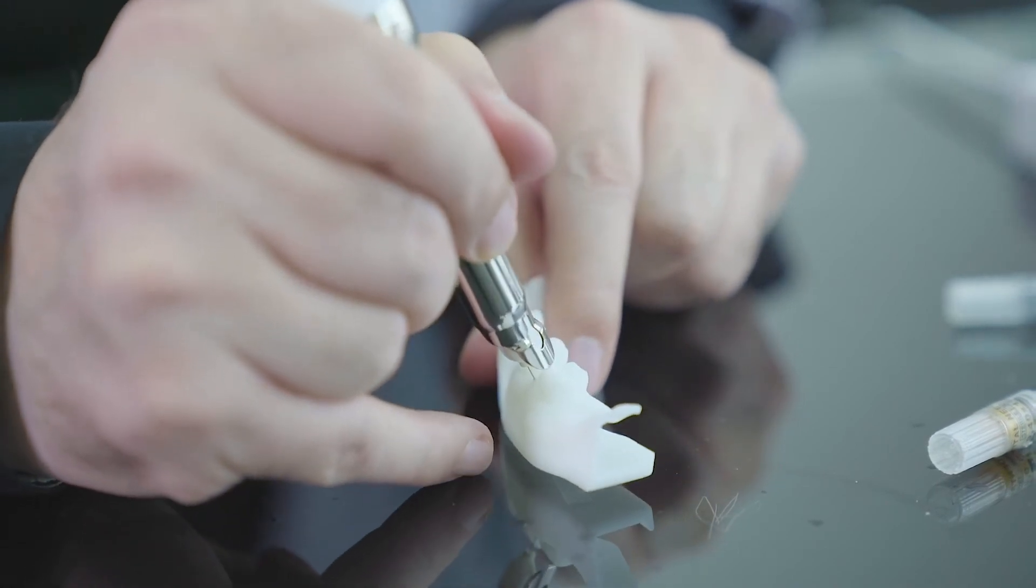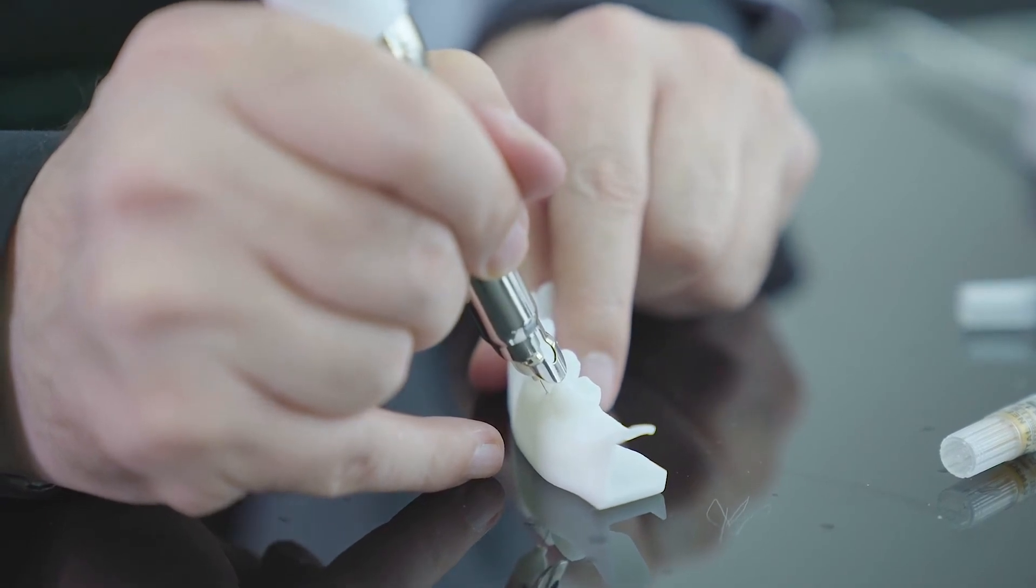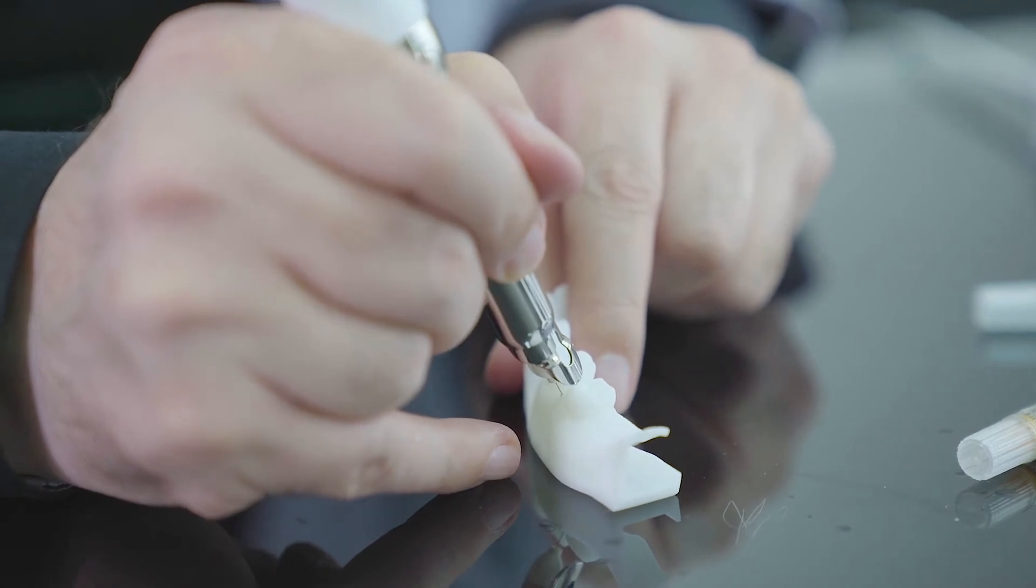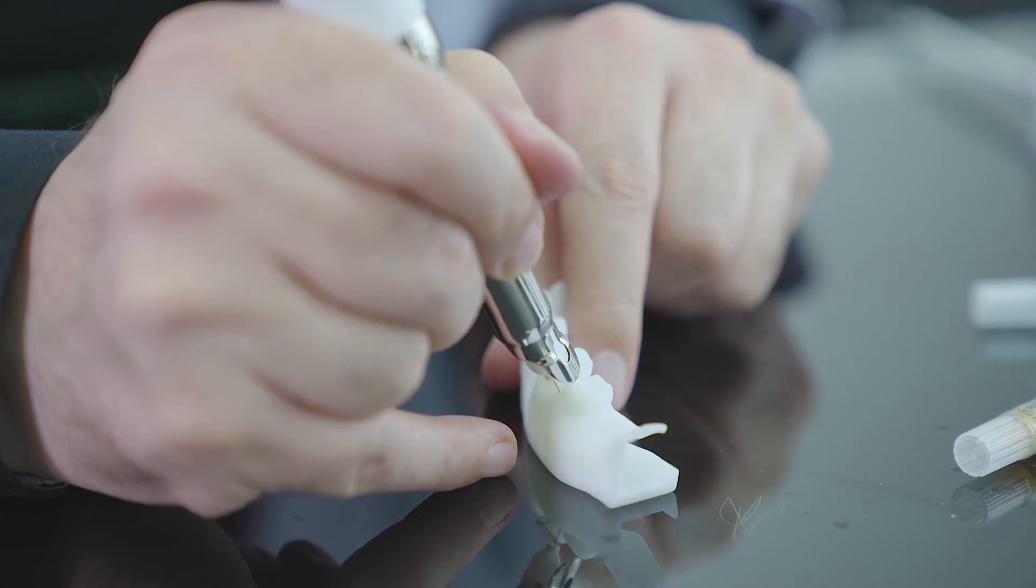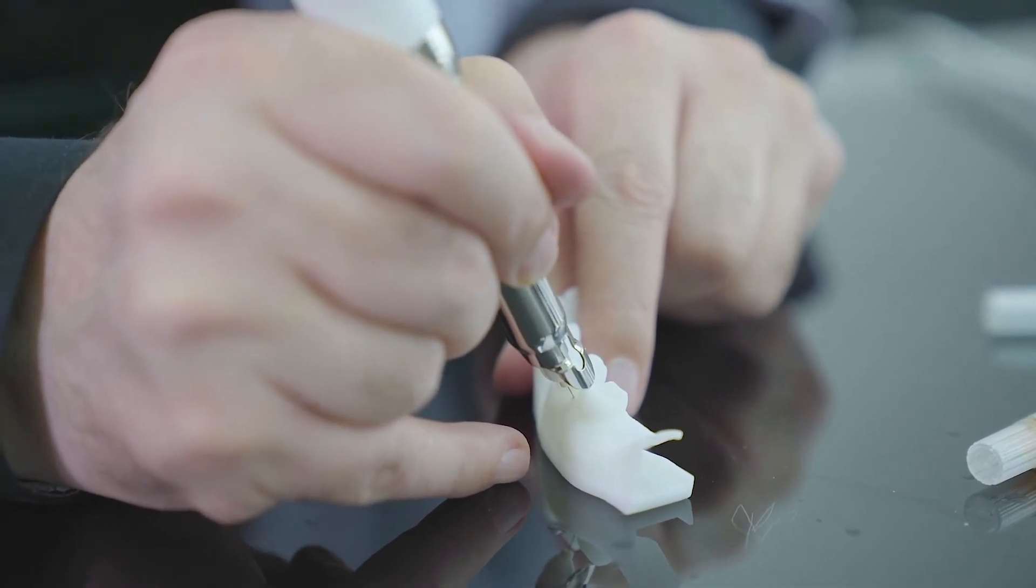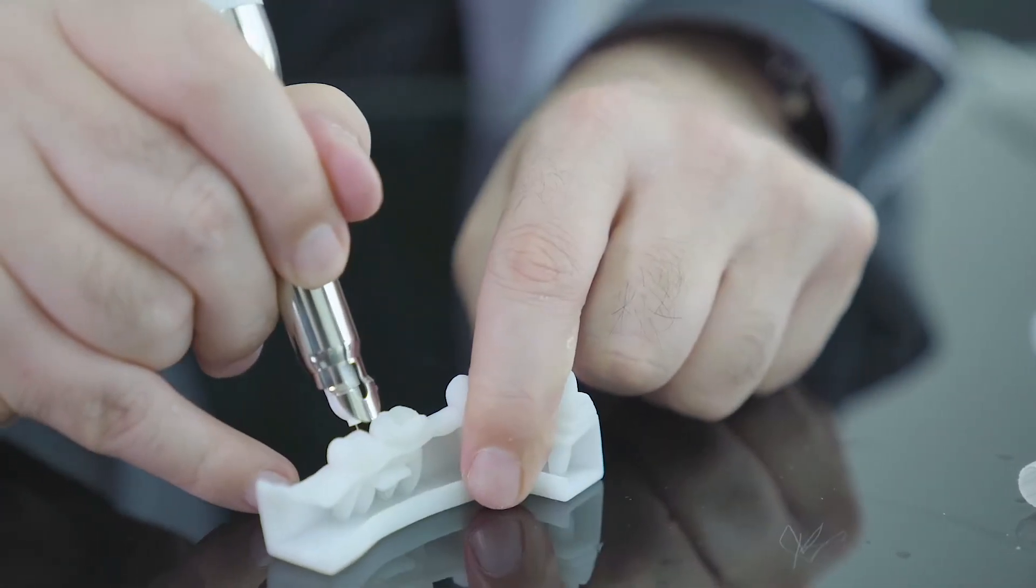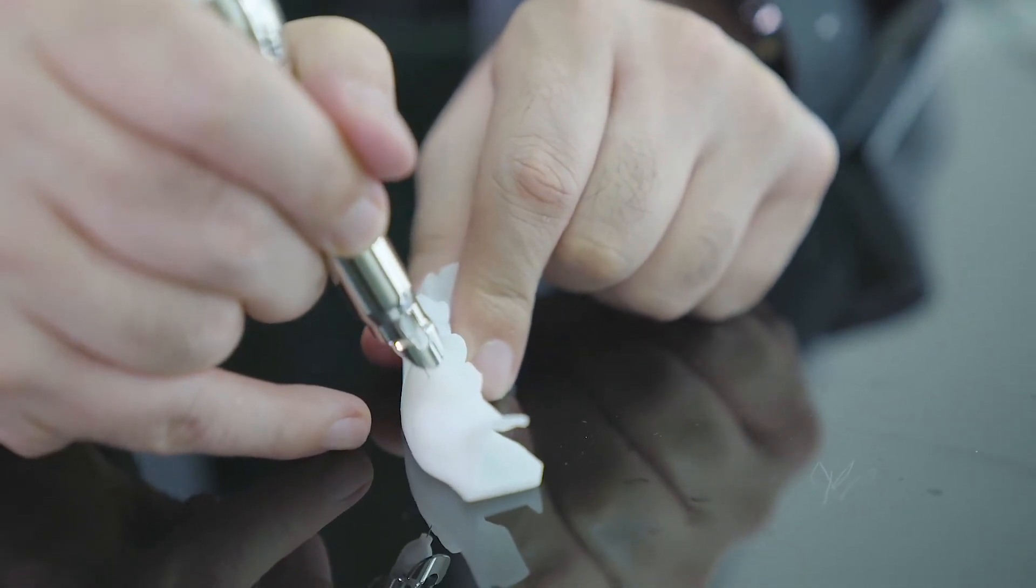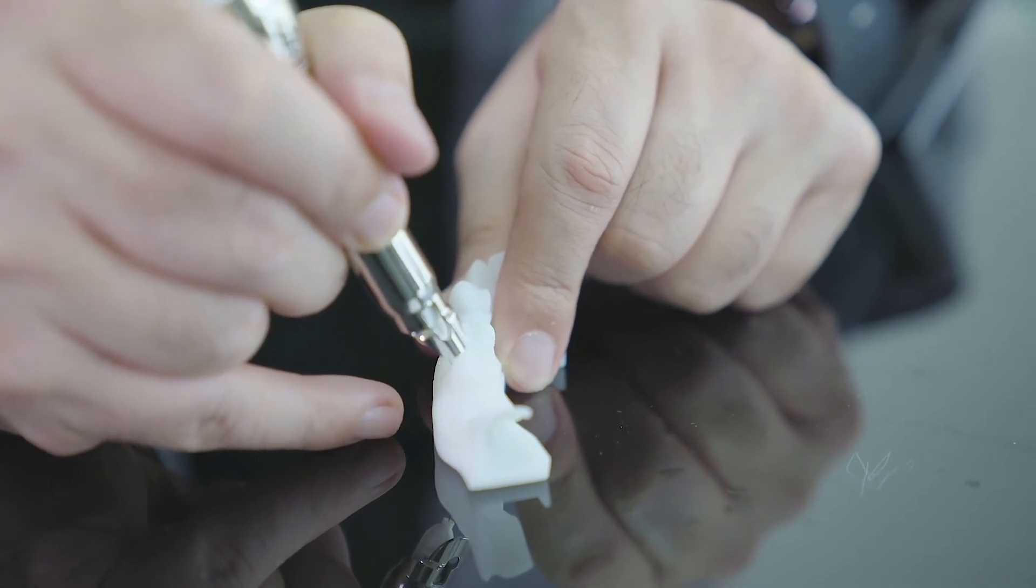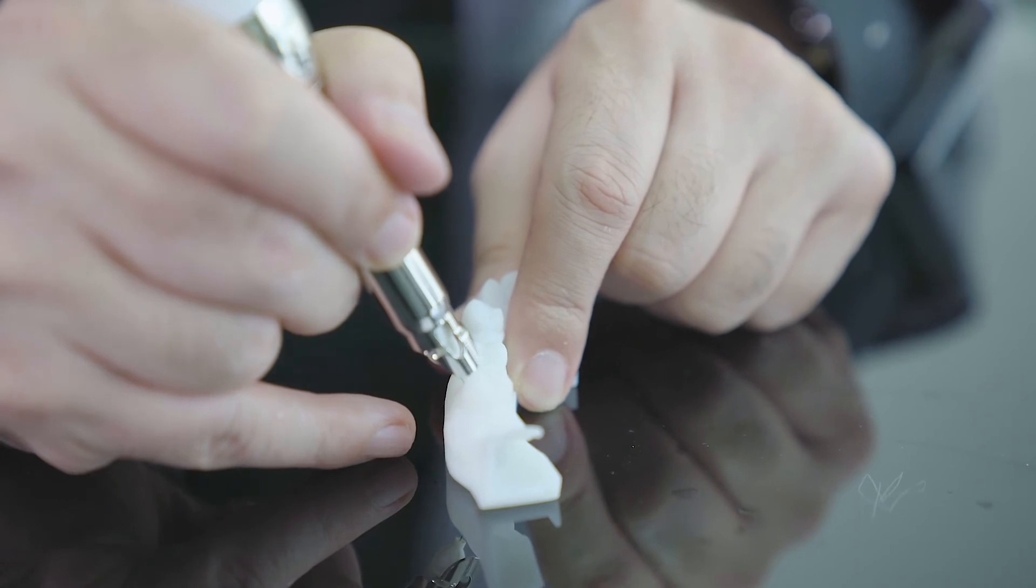Once I reach this position and this level of drilling, which is recommended to go within two-thirds up to three-quarters of the needle inside the bone, then I reach the third level, the third stage of my intraosseous anesthesia, which is injection. I will press the injection and inject my anesthesia material inside the cancellous bone, which will go mesial and distal to anesthetize from one up to seven or eight teeth, depending on the position and quantity of the injected material.